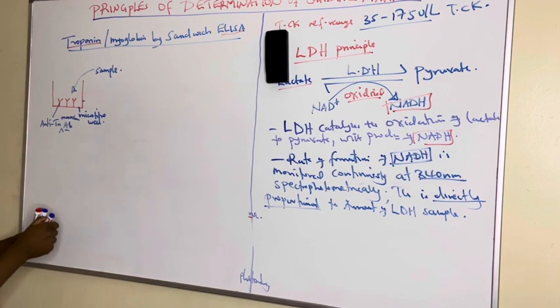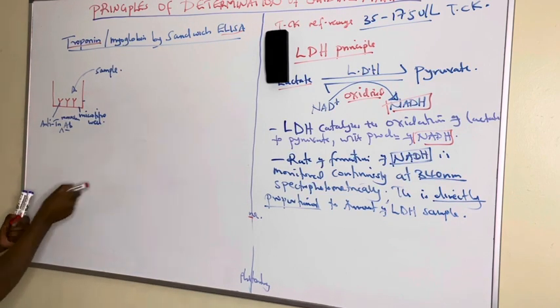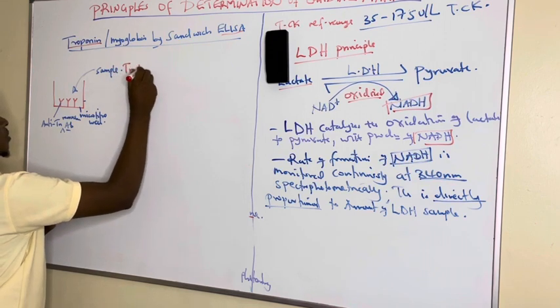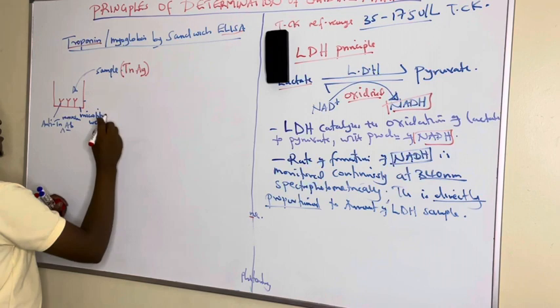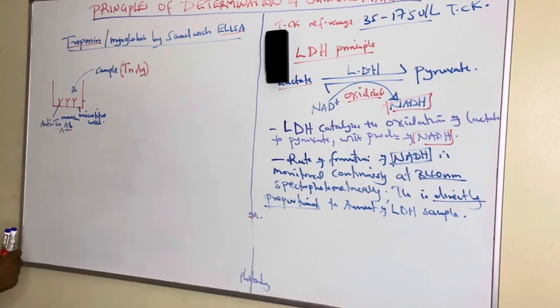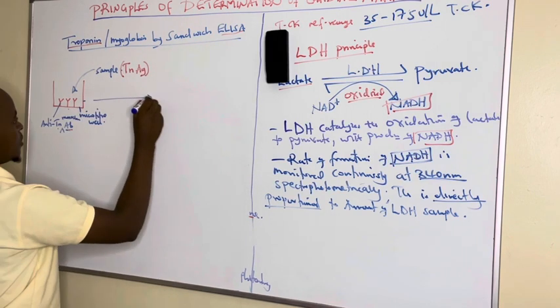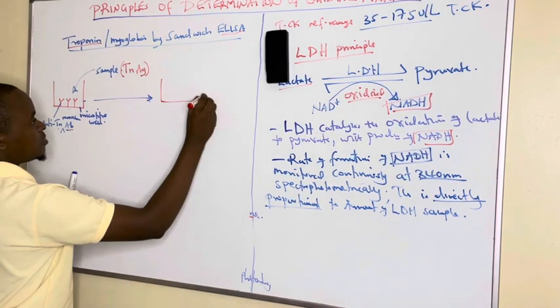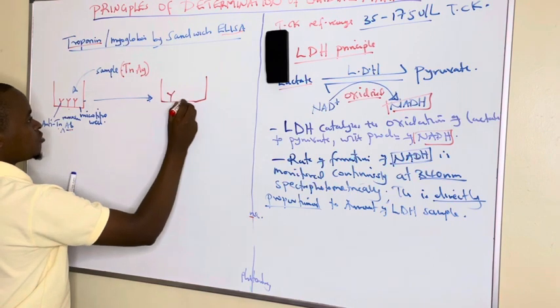And what is in the sample? This sample contains troponin antigens. And these troponin antigens in the sample are specific to these anti-troponin monoclonal antibodies pre-coated in the microtiter well. So when they are added, during incubation, we see this microtiter well, which is already pre-coated with the troponin monoclonal antibody.